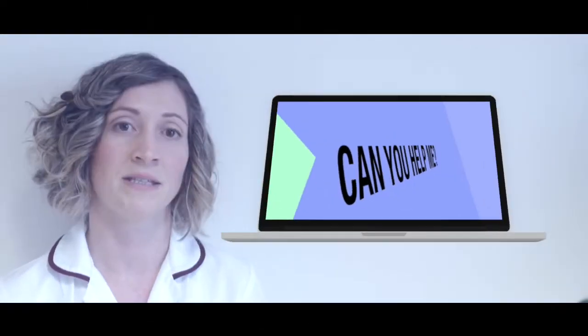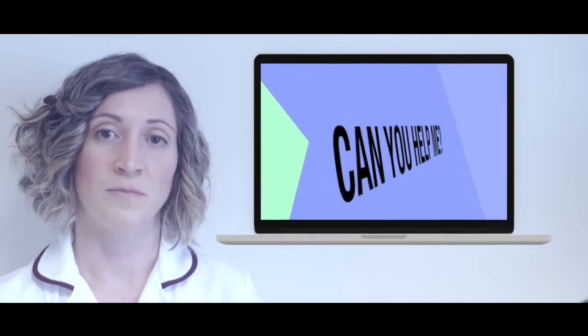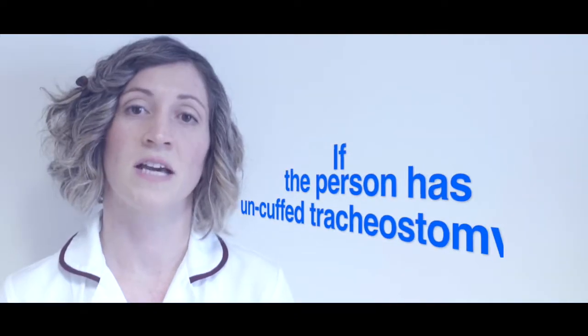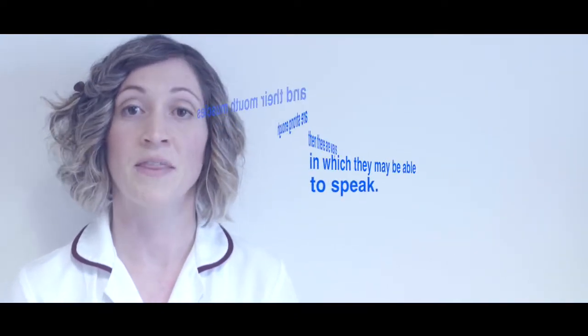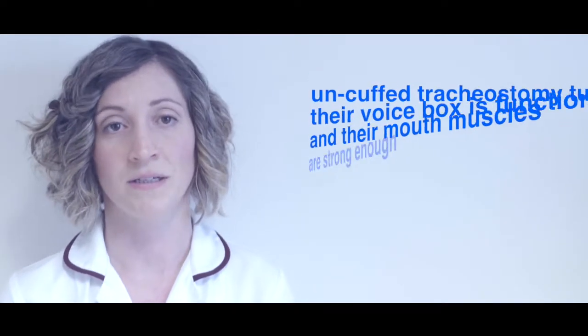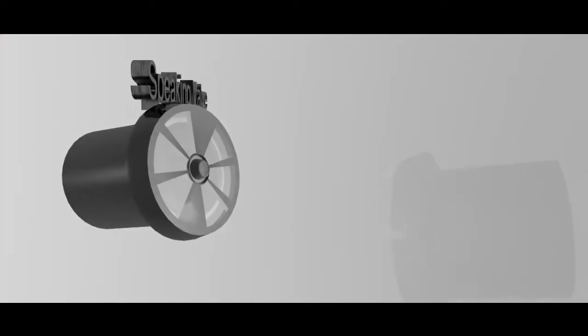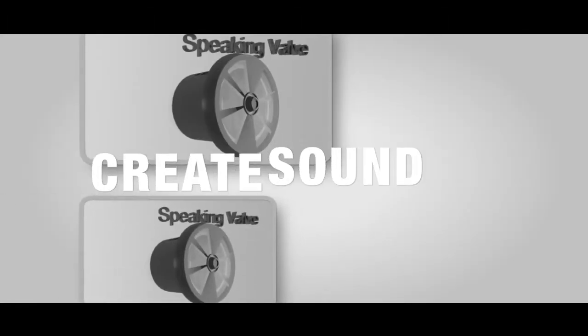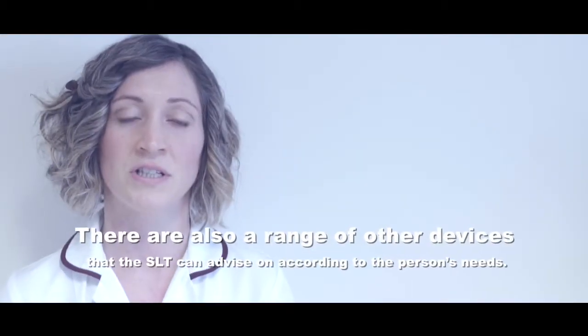Some communication aids allow you to write a message and the aid then says it out loud. You can get all sorts of apps for tablets which can be used for typing, drawing, or setting up personalised communication pages. If the person has an uncuffed tracheostomy tube, their voice box is functioning, and their mouth muscles are strong enough, there are ways in which they may be able to speak. Some people use their finger to cover the end of their tracheostomy, forcing air up through their voice box. For others, they may wear a speaking valve, which means the person breathes in via their tracheostomy and out through their mouth, enabling air to pass through their vocal cords and create sound. There are also a range of other devices the speech and language therapist can advise on.